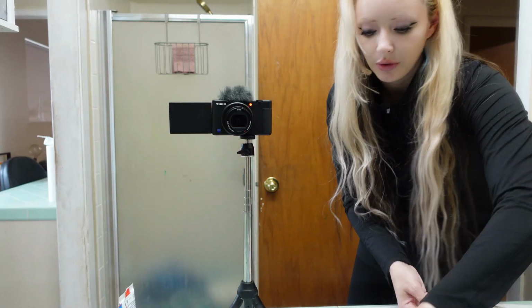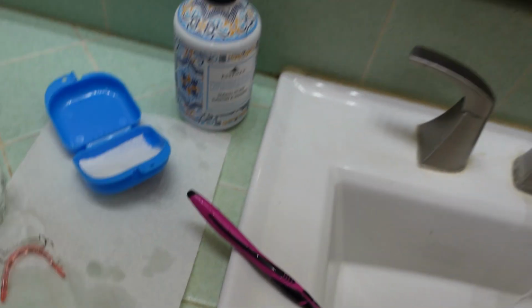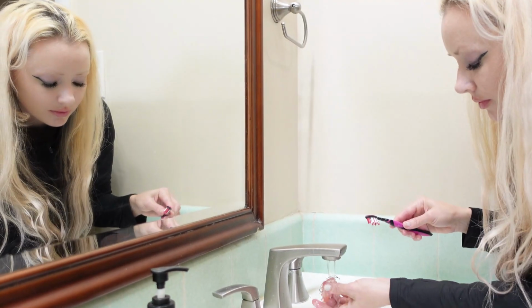And then you want to rinse it off really well so there's no toothpaste left over on it. And then I set it on a paper towel. Do the other one. Rinse it off.